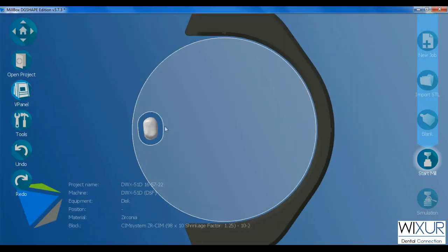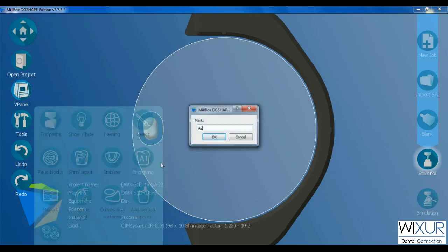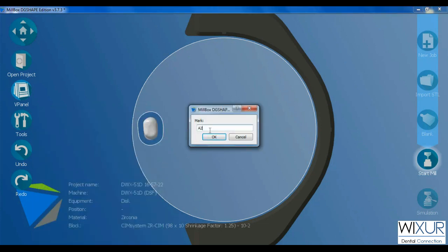Let's check some options in Tools. Click on Engraving, then select Insert. This option is useful when you want to have a printing on the surface of the crown — something like a color code, number, or other markings.